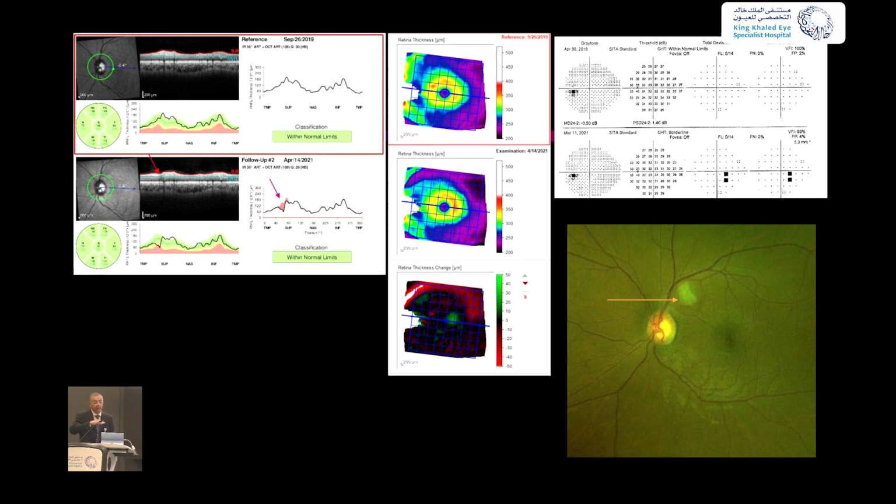I looked at the last 100 patients of mine. I found at least 10 eyes with small cotton wool spots that were completely missed on clinical exam. They're small enlargements of the nerve fiber layer, which I used to ignore. So why am I calling it the tip of the iceberg? Because that is only superficial ischemia. The biggest problem is middle layer ischemia.